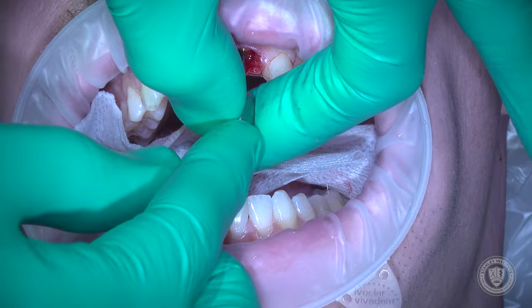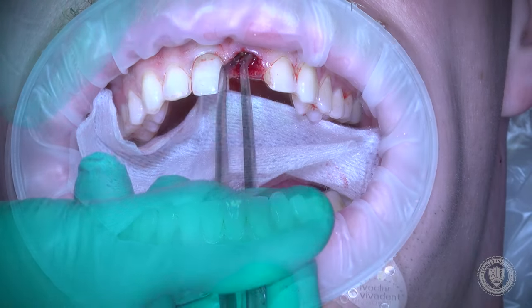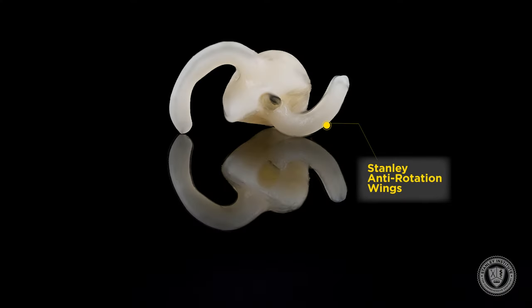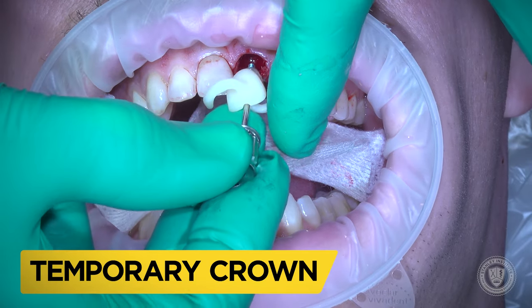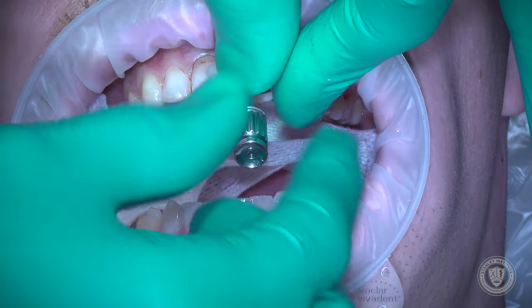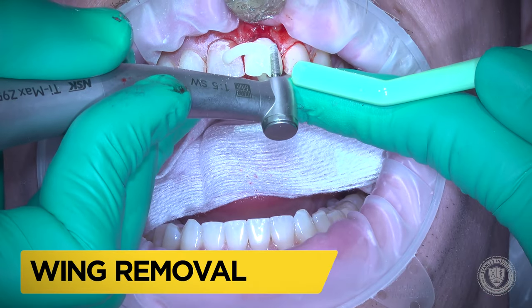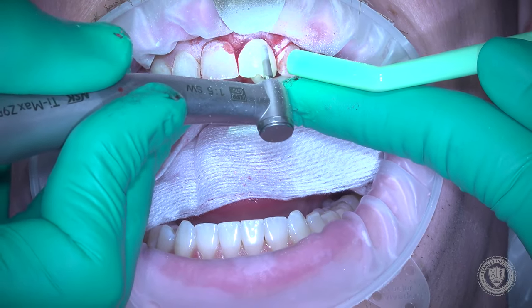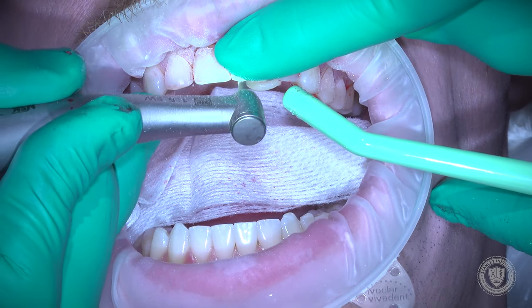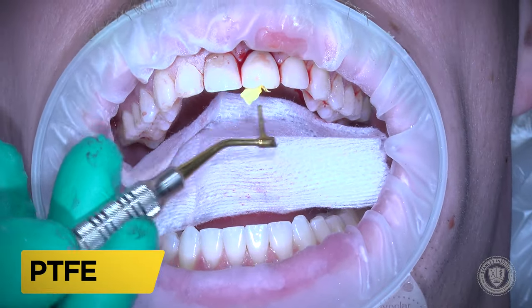After that's done, we're going to very delicately retrieve that healing cap. In this particular case, we have created a Stanley anti-rotation wings product. These wings are temporary on our provisional, which was made before the surgery off of the digital file. When we tighten this into place, the wings will prevent the crown from rotating, because we're using a non-hexed abutment — meaning there's no anti-rotation at the abutment-to-implant interface. The wings are removed quickly: come in with a coarse diamond, knock the wings off, polish with a soft flex disc, and you're done in just a few seconds.